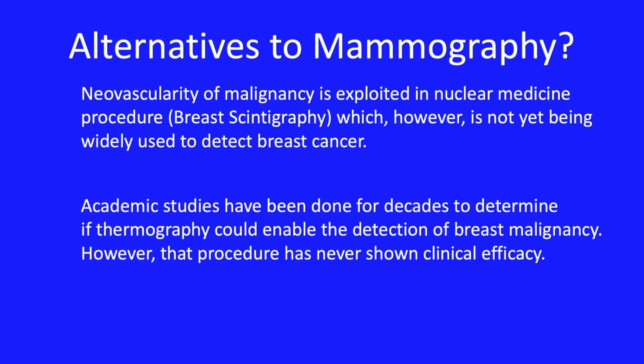In addition to the medical imaging modalities of mammography, ultrasonography and MRI, work is also being done in the nuclear medicine procedure of scintigraphy mammography, but this is not being widely used. However, alternative medical practitioners have been promoting the use of thermography as a means for women to avoid the ionizing radiation used in mammography. Such promotion grossly exaggerates the risk from the incredibly small radiation exposure and absorption in mammography and is dishonest in representing that thermography has ever shown efficacy for breast cancer diagnosis.